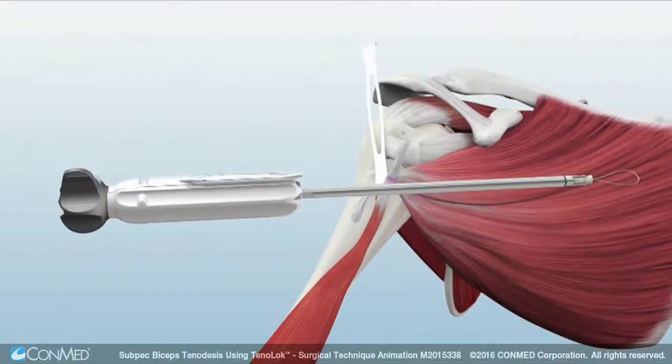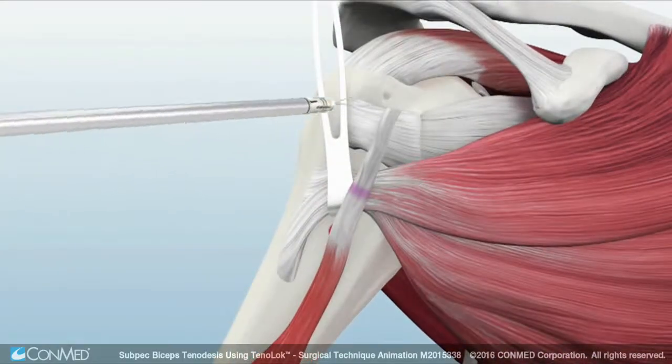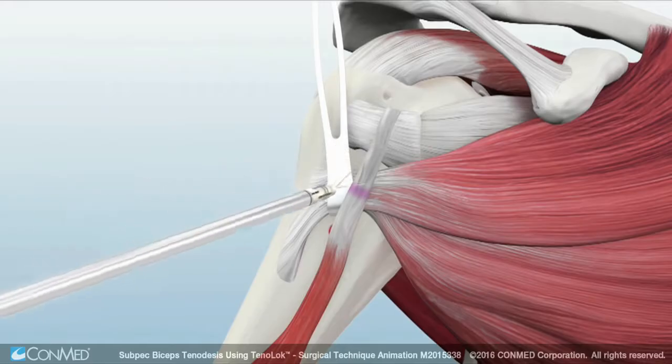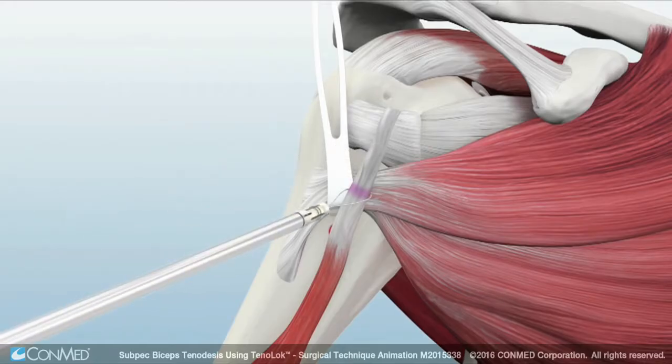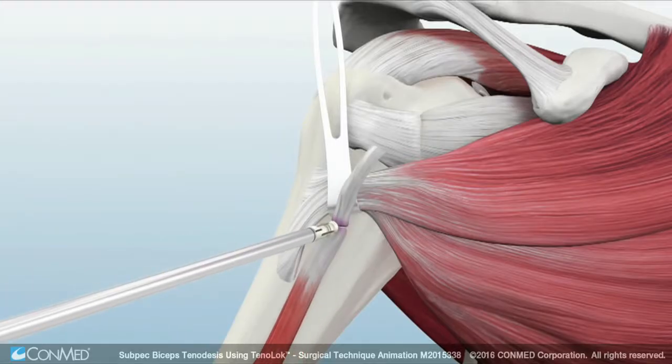Then pass the biceps tendon through the hi-fi suture loop at the leading edge of the Tenoloc implant. Align to the 20 mm marking and then tension and cleat the suture to secure the tendon to the implant. Orient the biceps tendon so that it exits the bone inferiorly toward its distal insertion point.